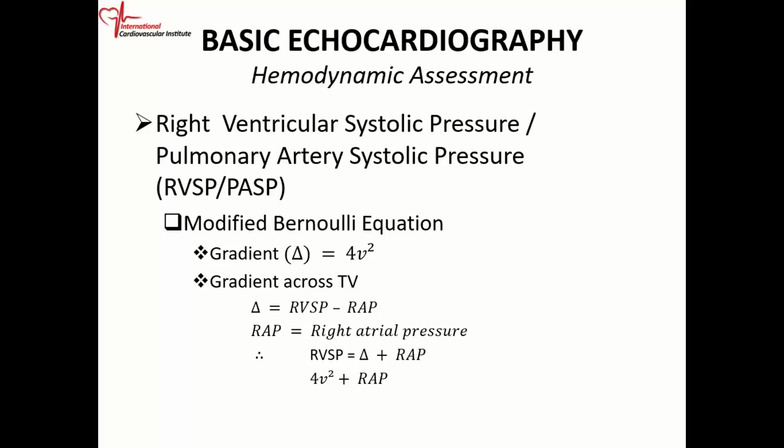And when we start looking at the right side of the heart, we'll go into this a little bit more. But one very important calculation that we do in echo is the RV systolic pressure, right ventricular systolic pressure. Because if the RV systolic pressure is very high, the patient can develop right ventricular failure.